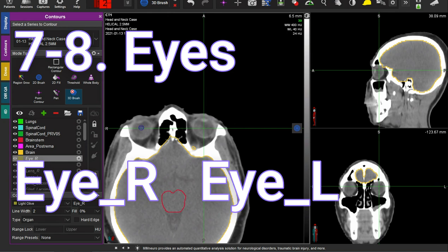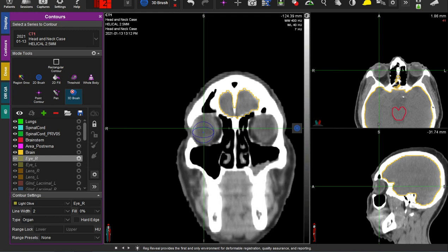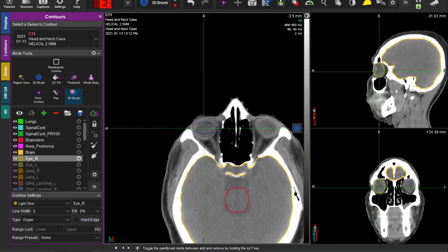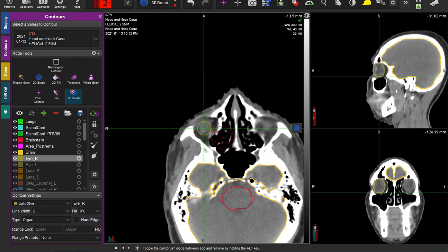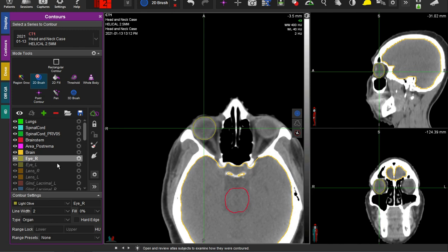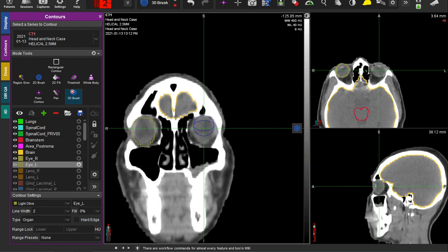We'll begin with the right eye. What I like to do is make a sphere about the diameter of the eye, centered in the middle. You go to the middle on the sagittal, coronal, and axial slices, then make your sphere about the diameter and click. Looking at the sagittal, I can see I'm missing maybe just a few slices superiorly and inferiorly, so I'll adjust. Now we'll do the same thing for the left eye — I really recommend this trick using the sphere. Most eyes are shaped like a sphere with only minor adjustments afterwards.